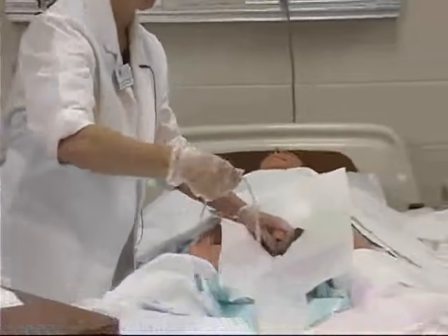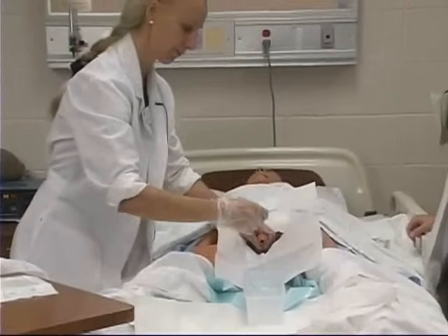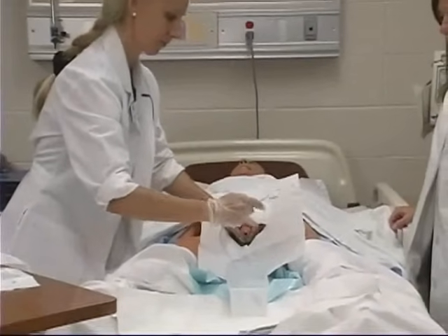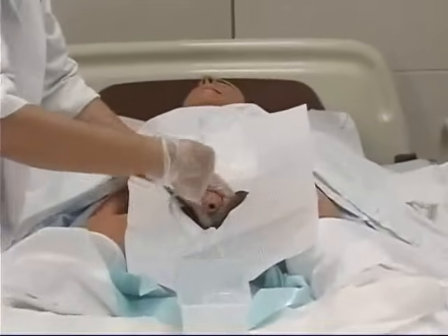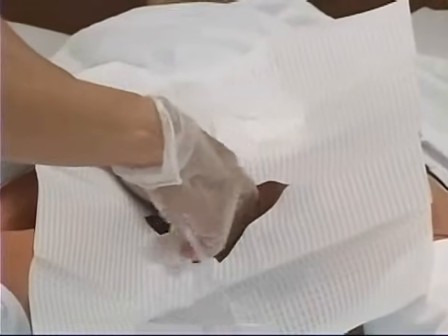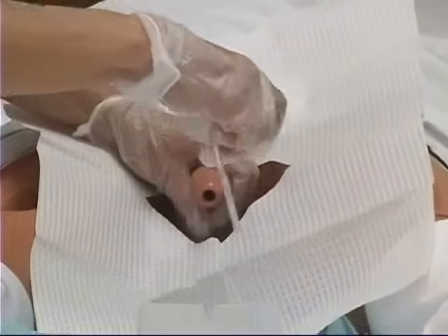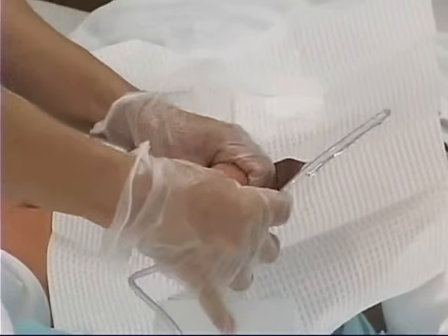That's just a guideline. You're going to want to make sure that you're going to get a urine return. Get up closer to the tip of your catheter so that it's not wobbling. This is where the drape can come in handy in case you have too much and you accidentally touch the side of the patient.